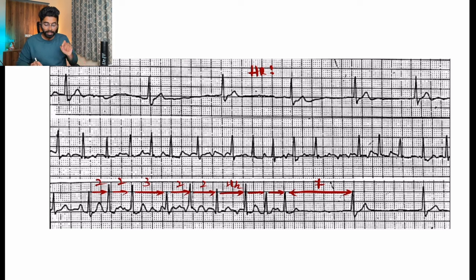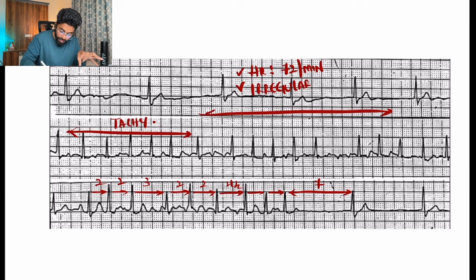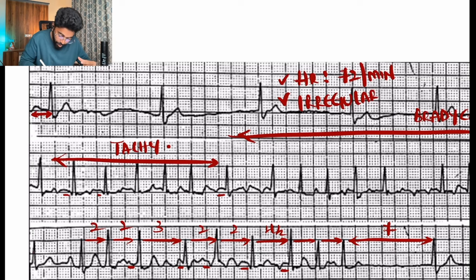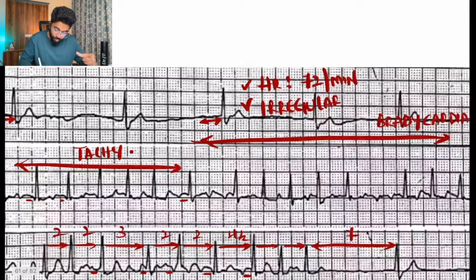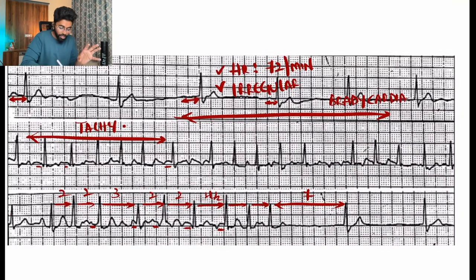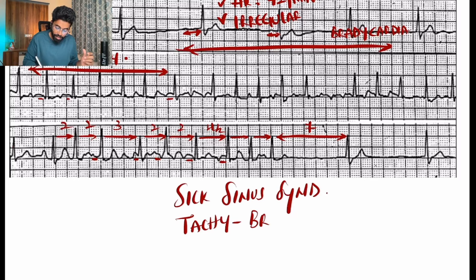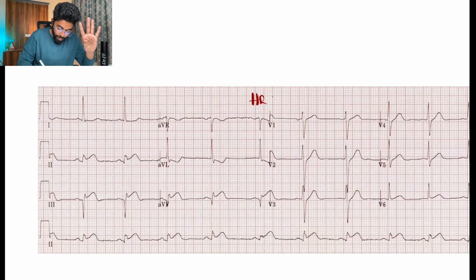This ECG clearly shows an irregular rhythm. We can see that in some leads there is tachycardia and in some leads there is bradycardia. There is no PR interval in some areas, and in others the PR interval is broader and prolonged, which clearly shows dysfunction of the SA node — this is sick sinus syndrome, also known as tachycardia-bradycardia syndrome.